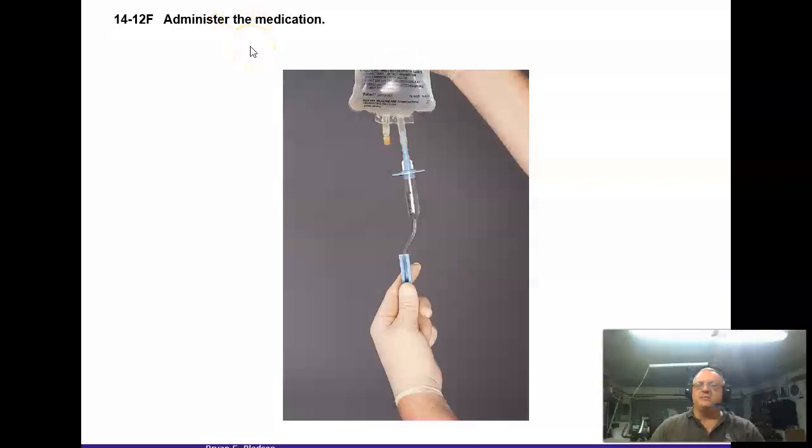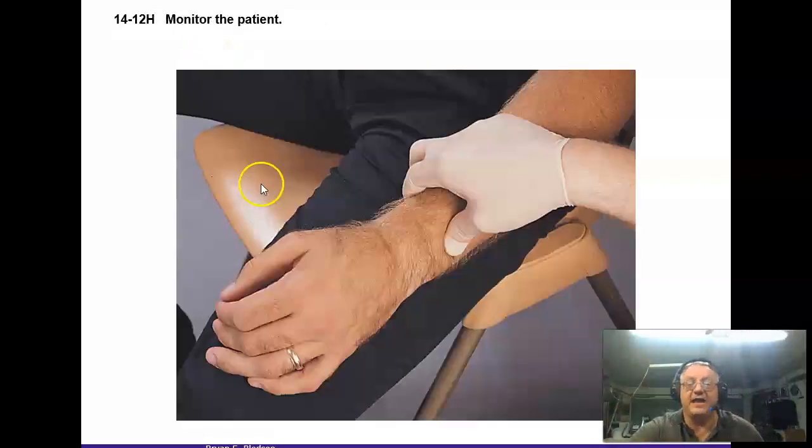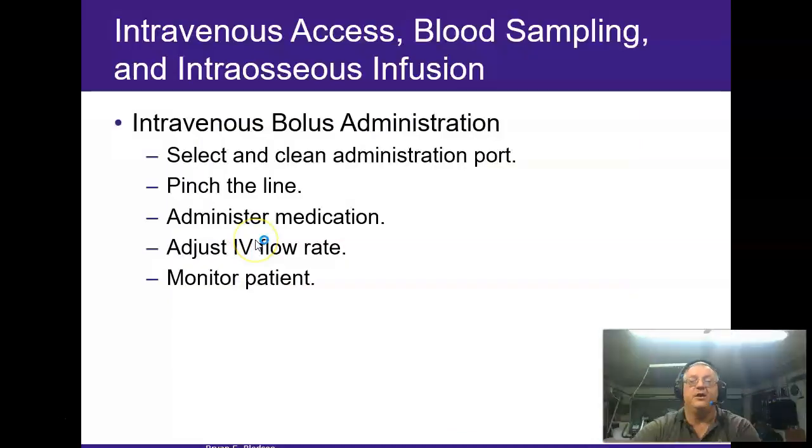If I know that I'm going to be giving a lot of medicine, let's say a cardiac arrest, I'm going to hang a bag, okay? Because it's a lot easier to go flip than it is to go, okay, let me get this, okay, and no, that's a pain in the butt. Put your IV tubing, hang a bag up there, flow your stuff, okay?